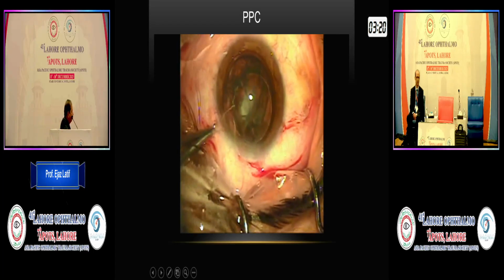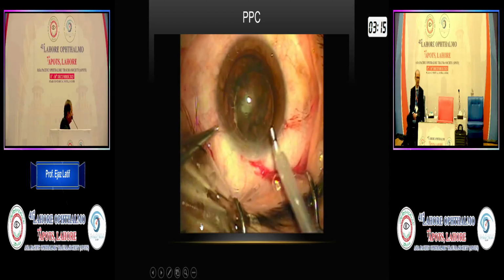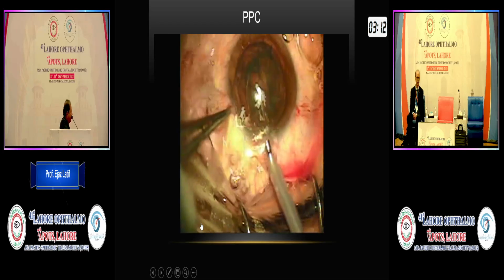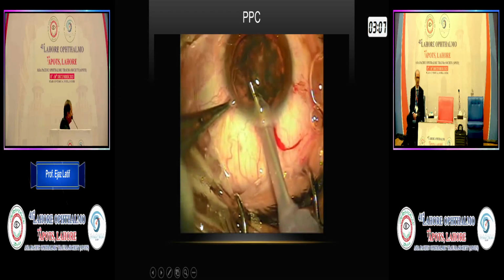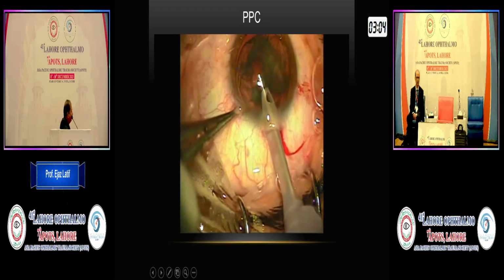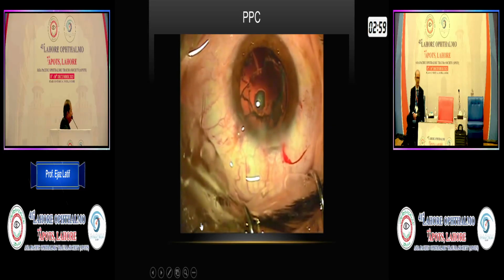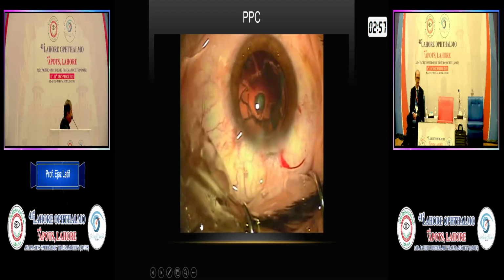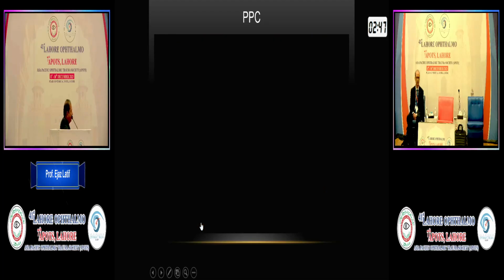This is another case with a soft nucleus. Now, in case of a soft nucleus, especially in such cases where there is a chance of PC rent, I use this technique, which I have been showing you for the last few years. And you can see that it's still undisturbed here. So the nucleus is removed, and the epinucleus and cortical complex, as well as the posterior polar cataract, are still intact. So there is no chance of nucleus drop in such cases now.